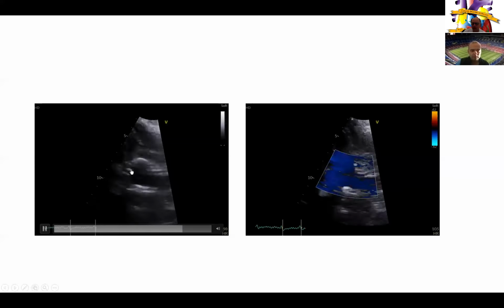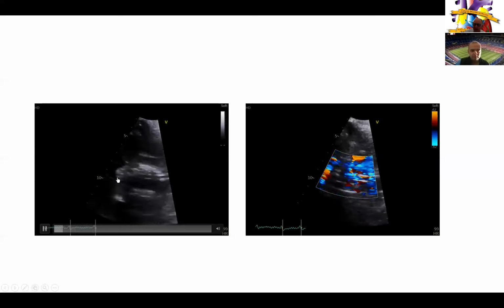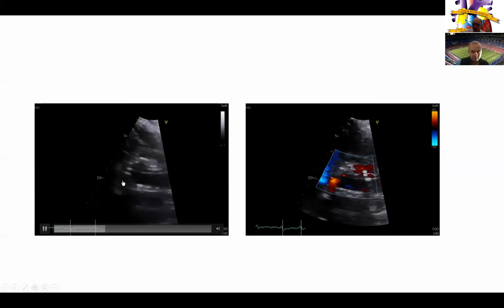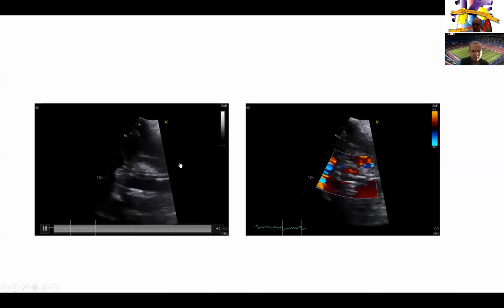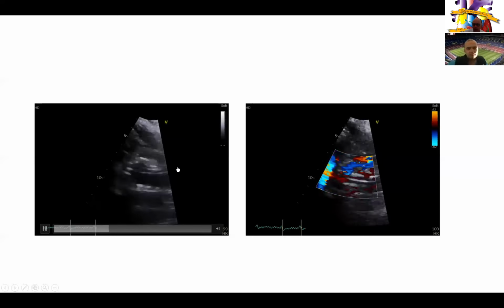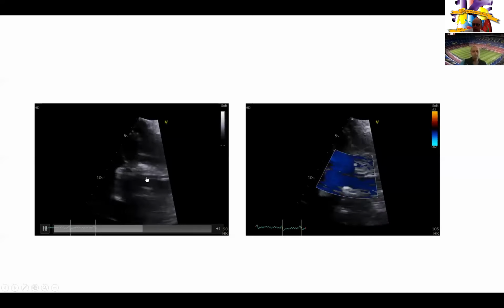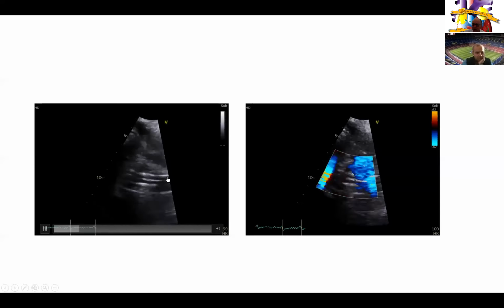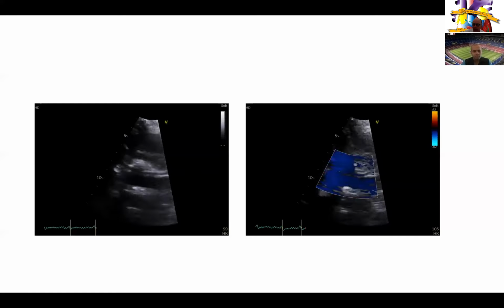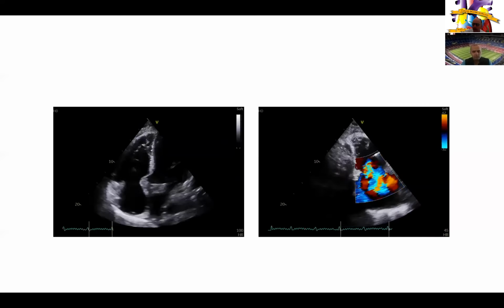You have to strain your eyes to see something here at about 9, 10 o'clock, but this could be a tricuspid valve structure. It's just hard to see. And again, we look for shunting anywhere here, or a defect at the level of the aortic root, and really it's very hard to define anything here on these limited images.